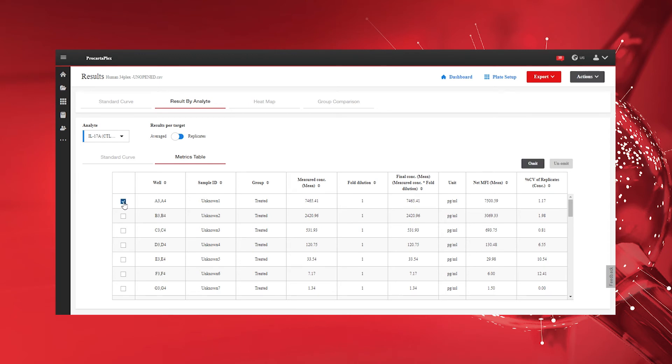If necessary, remove wells from the analysis by clicking the checkboxes on the left, followed by the Omit button.